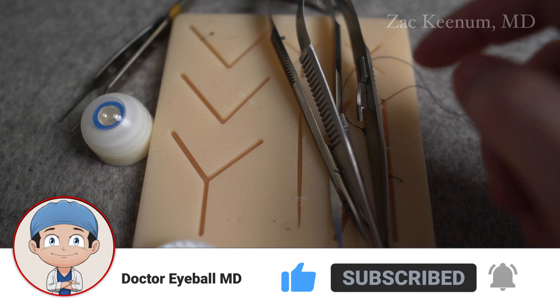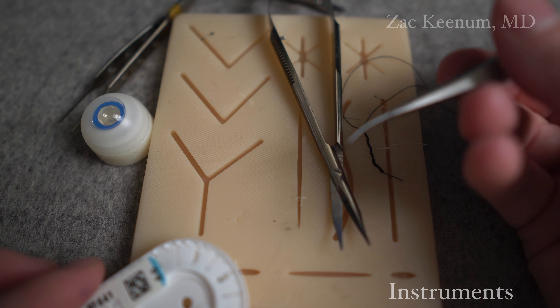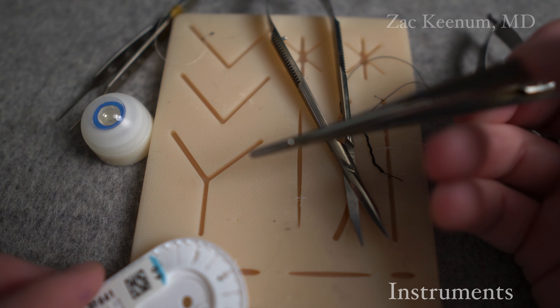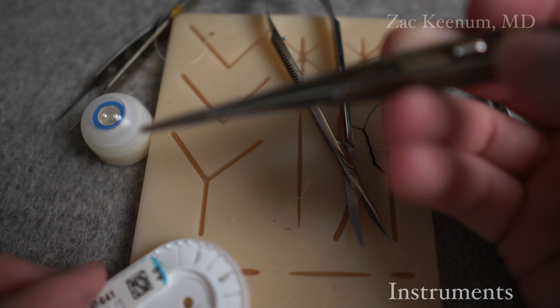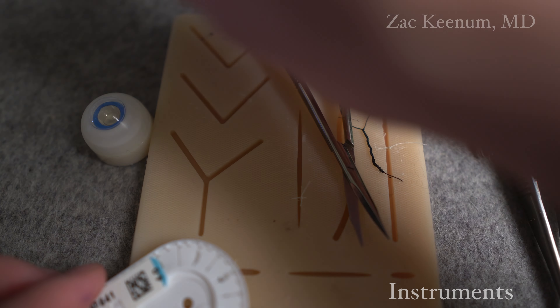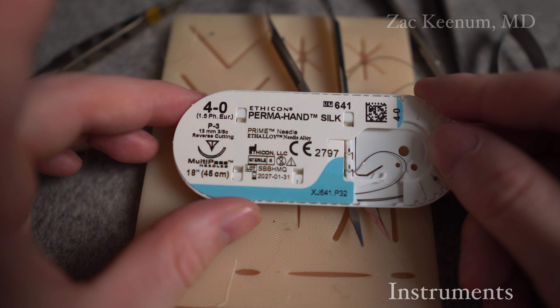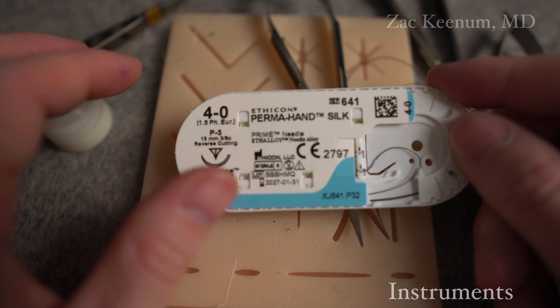I have my Westcott scissors. I have my needle drivers - in this case, locking. We have a curved version, and they come in a straight version, Castro Viejo locking needle driver. Then I have a Bishop Harmon 4 set, which we'll need. And lastly, we're going to be working with 4-0 silk suture on a reverse cutting P3 needle.